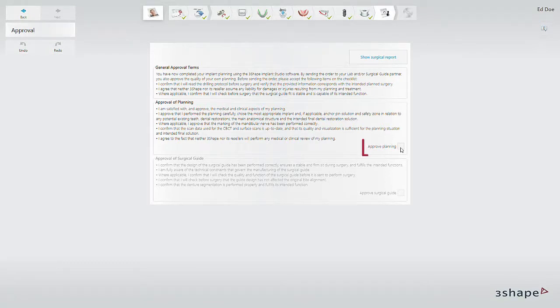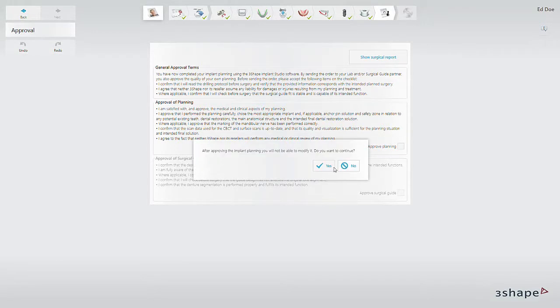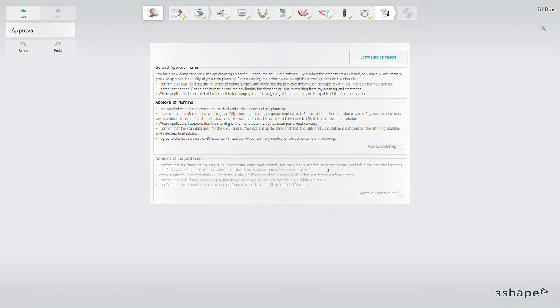When you finish designing your case in Implant Studio, start by approving the planning. The system warns you that you will not be able to modify the implant planning once you've approved it.